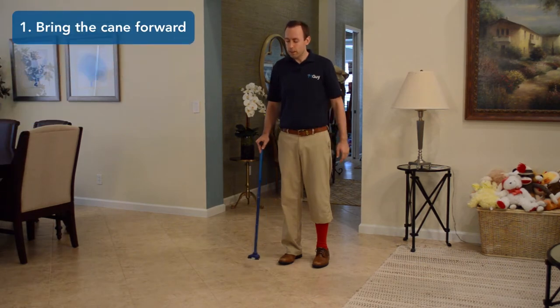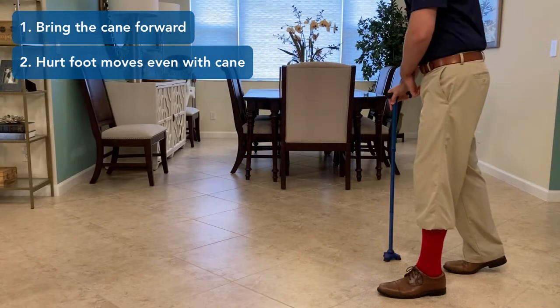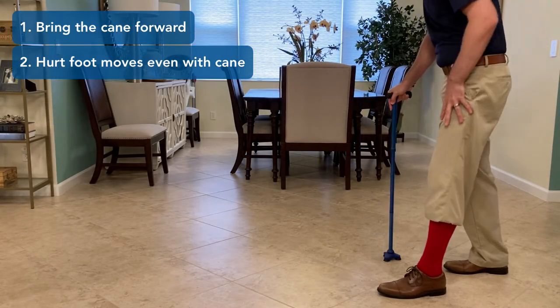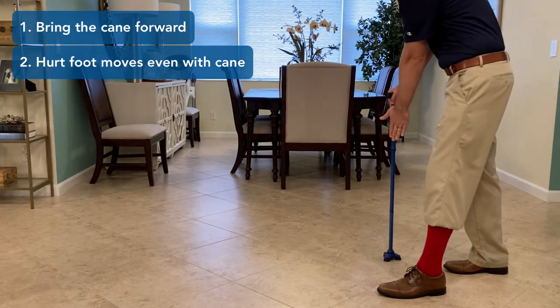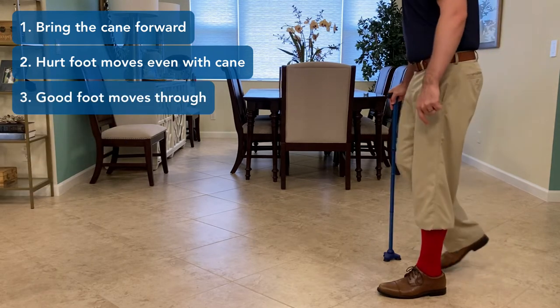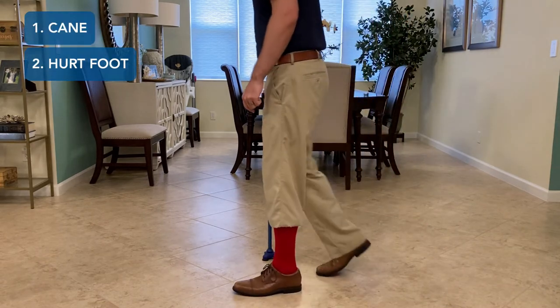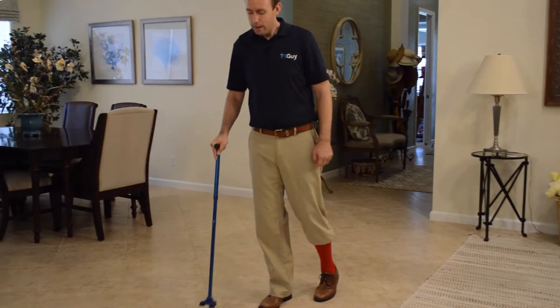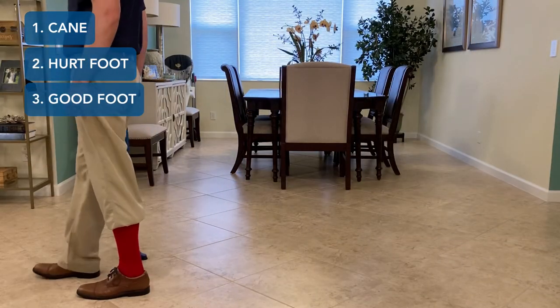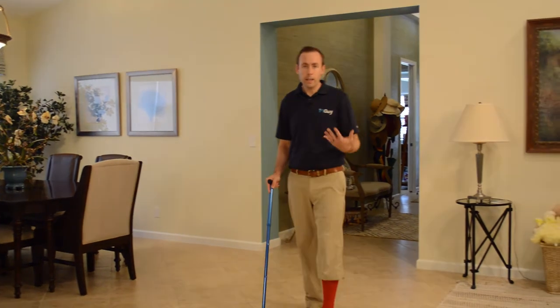The first thing you do is bring the cane forward. The left leg comes up to the cane — that allows the weight to transfer over to the cane side. Then the right leg comes through. Cane, left leg, right leg. Cane, left leg, right leg.